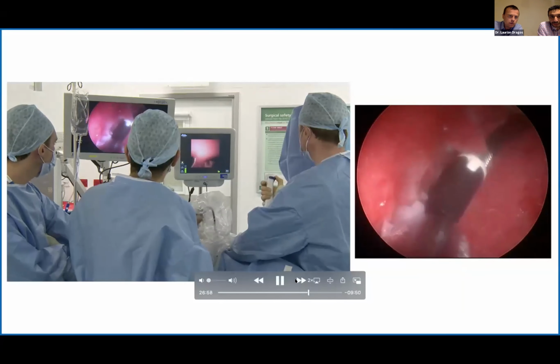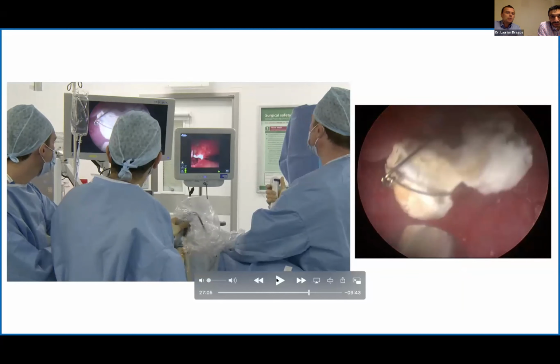So I continued with, okay, that's a good image because it shows me manipulating the scope, the ureteroscope. Kasra is here with a nephroscope, and Alberto, our very skilled registrar, is close to Kasra. So we are working very close together and collaborating, discussing, pointing, looking in the same direction. So the theater setting is important as well. And the teamwork, I love it, at least I love it. And it's really good to have the opportunity to work with.